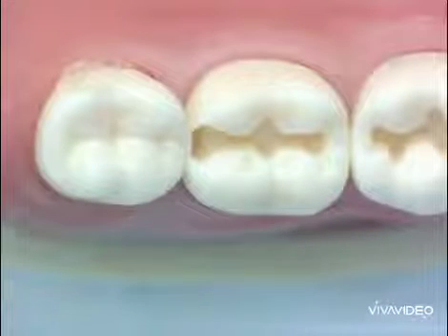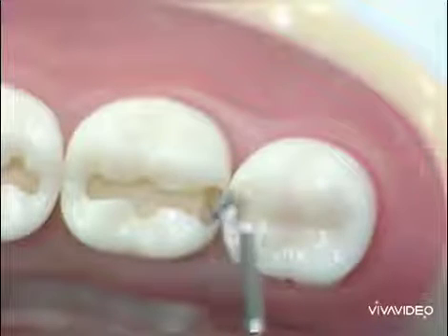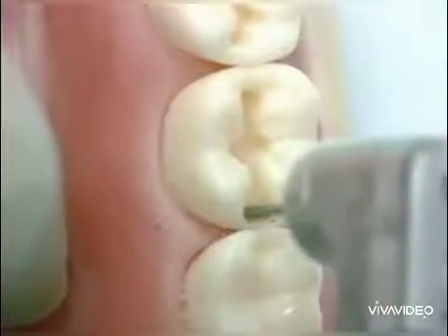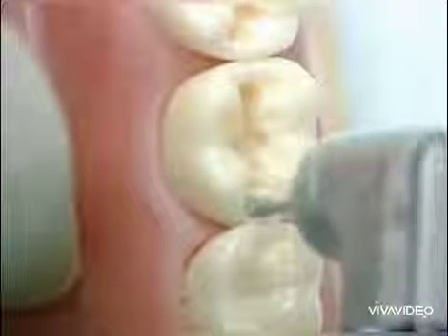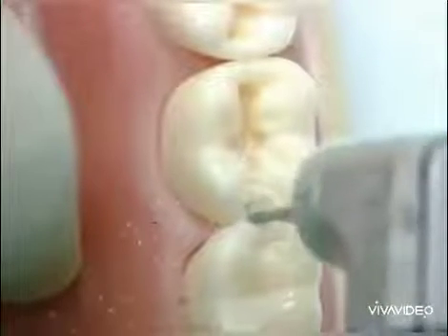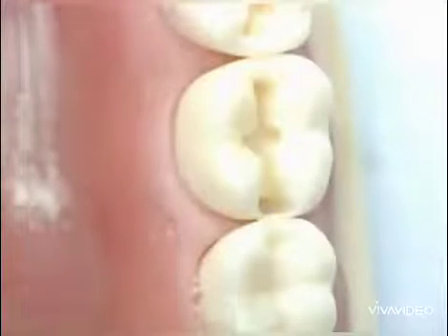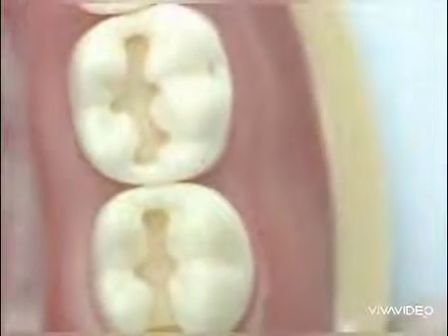This is how to create the proximal box. This is the gingival seat, as you can see with the probe, and the axial wall. We create the gingival seat and axial wall, leaving a thin shell of tooth structure. Now we will break the remaining thin shell of tooth structure and open the contact with the adjacent tooth to provide convenience form and uniform accessibility along the entire length.